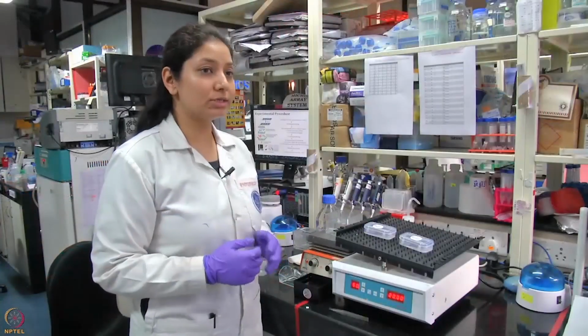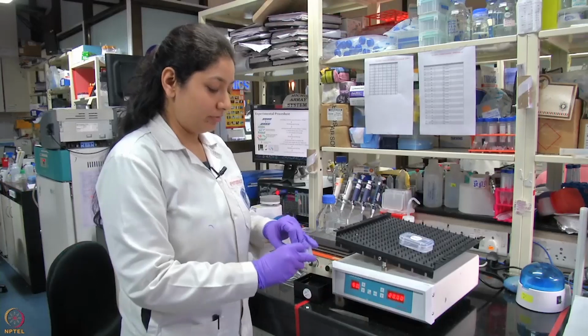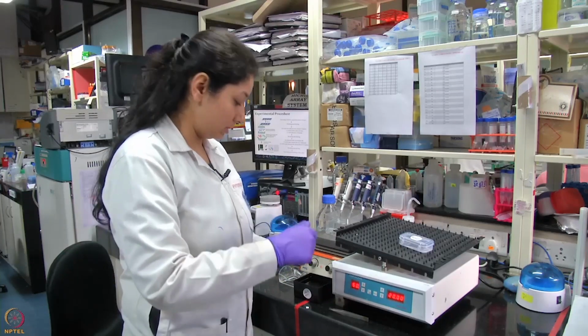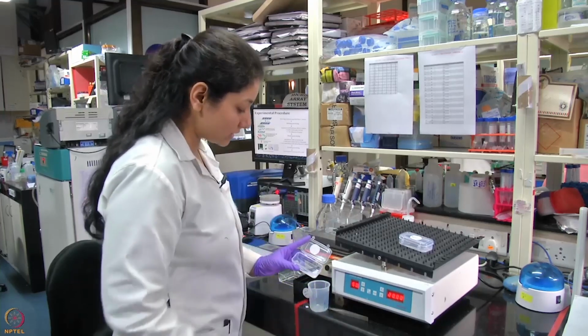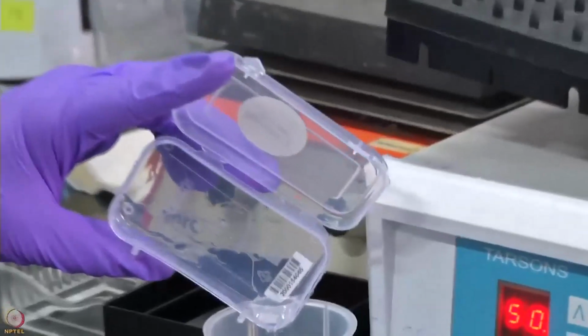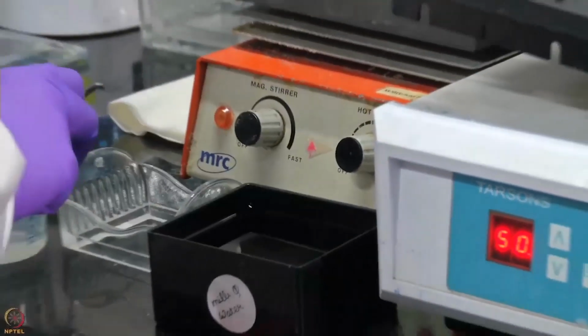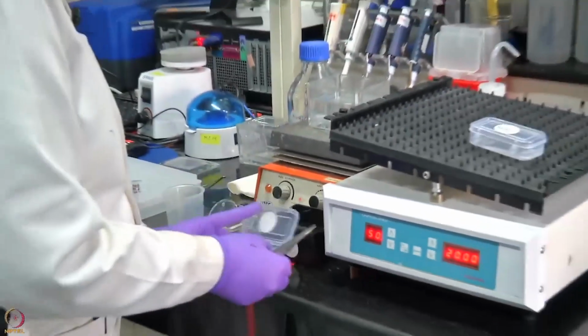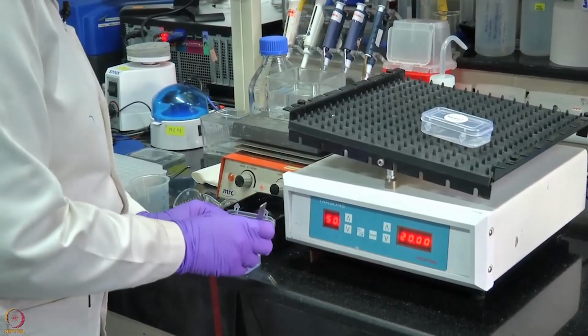Once this blocking step is completed, we take this blocking buffer out. We carefully decant the buffer into the discard. Make sure that the slide doesn't fall, and remove the blocking buffer properly. Once that is done, take the slide carefully without touching the protein spots.